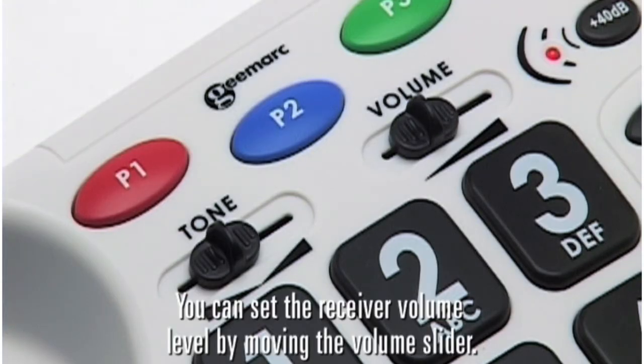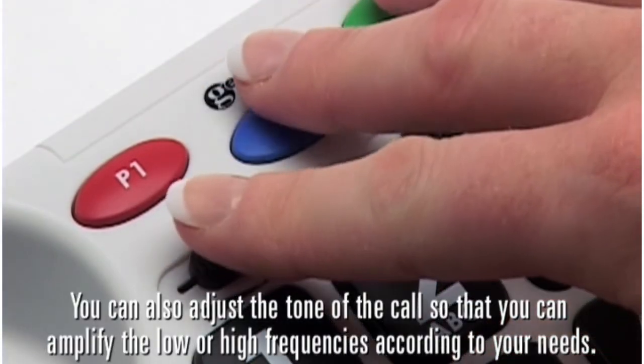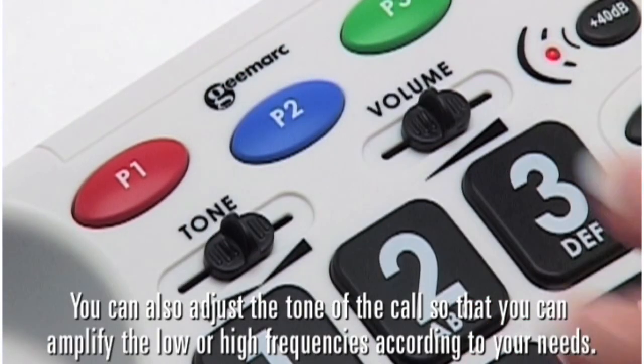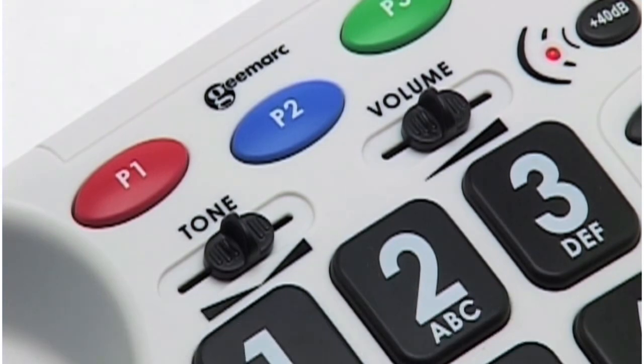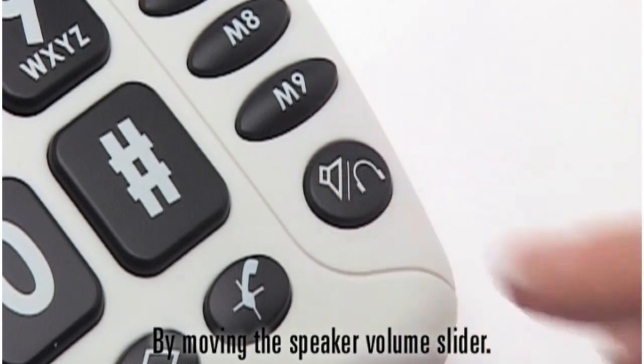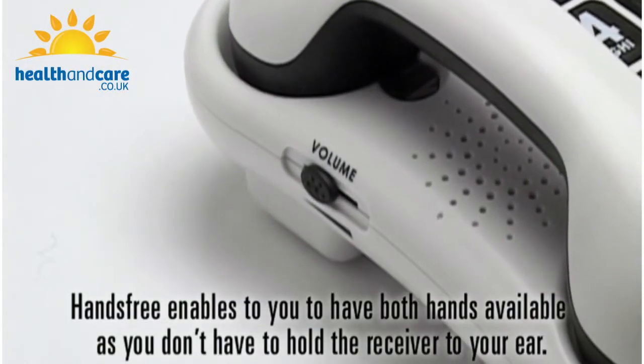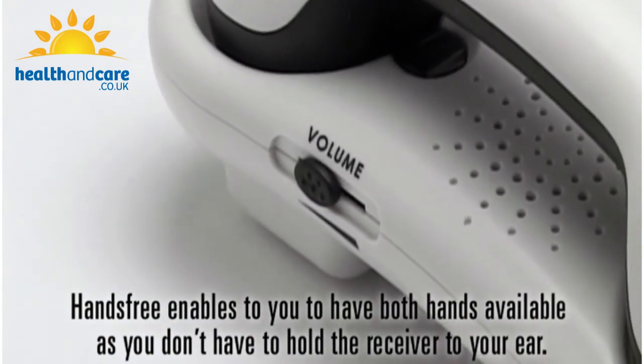You can set the receiver volume level by moving the volume slider. You can also adjust the tone of the call so that you can amplify the low or high frequencies according to your needs. You can set the hands-free speaker volume level by moving the speaker volume slider. Hands-free enables you to have both hands available as you don't have to hold the receiver to your ear.